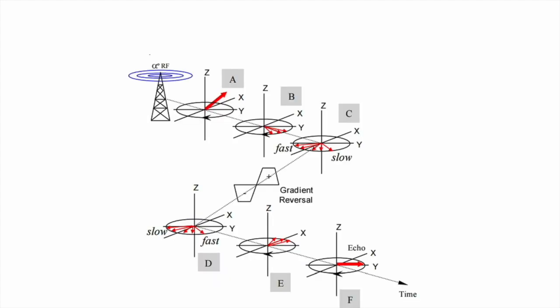The RF pulse in a gradient echo sequence causes dephasing of protons. With the initial positive gradient, there is rapid dephasing. The negative gradient that immediately follows causes rephasing of protons, resulting in an echo signal. Since the gradient echo sequence does not rely on a 180-degree refocusing pulse and much smaller flip angles are possible, the sequence is much faster than a spin echo sequence.